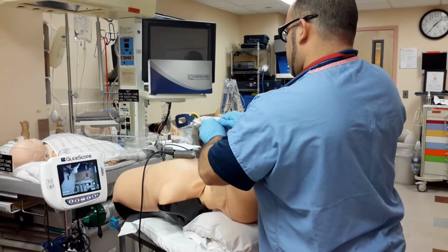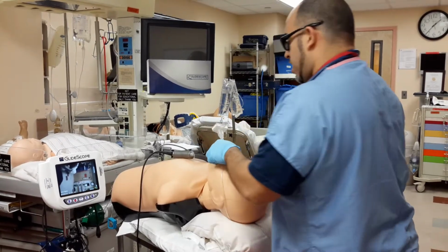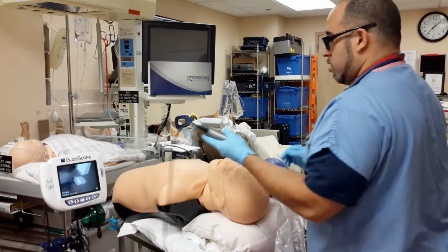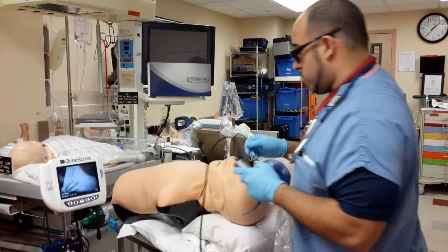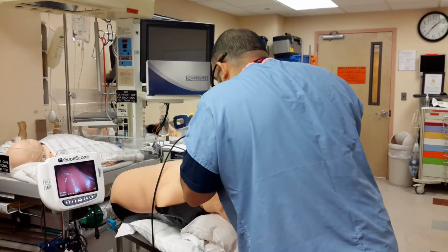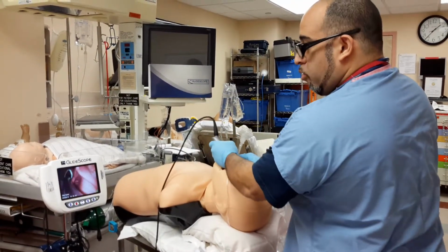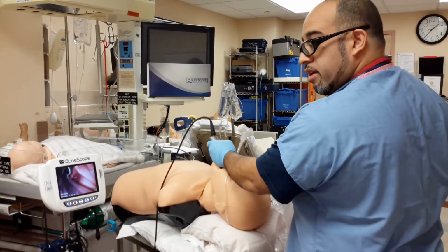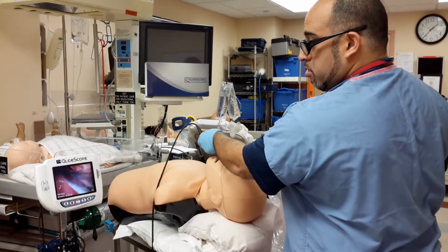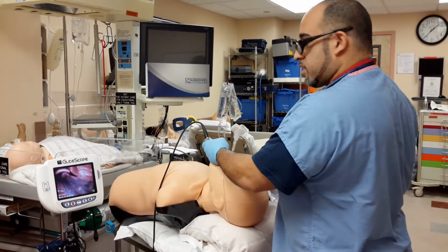Okay. Now I need to tell you some things. It is very tempting that while I'm intubating, to look at the screen only. And if I only look at the screen only, I have a feeling this is what's going to happen. You're going to look at the screen and get a better view and start rocking. Teeth will break. As a teaching and learning tool, this device is best used as a direct laryngoscopy blade.